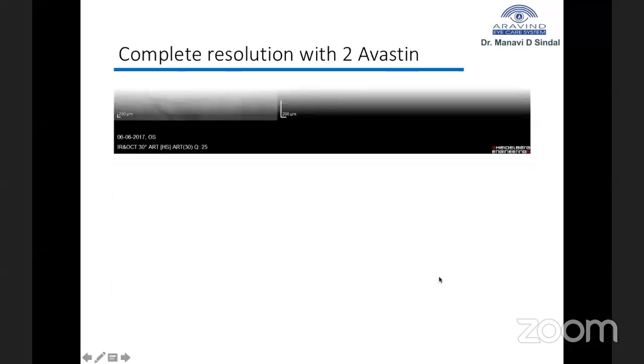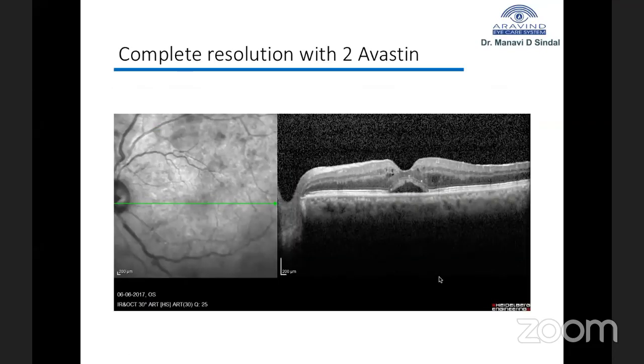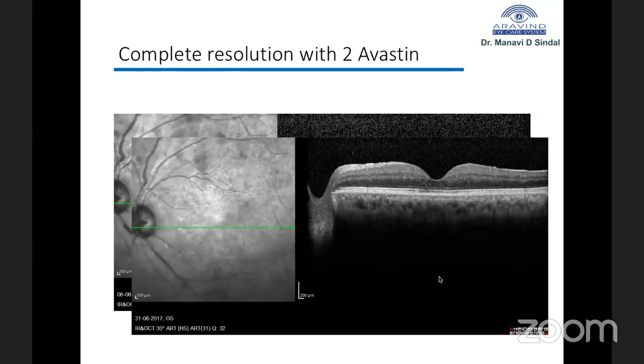So where this is leading us is that one of the hypotheses is that HRF could be indicative of a stronger inflammatory pathology behind the origin of DME. And that is why patients with numerous HRF may do better with steroids or may need an earlier switch over from an anti-VEGF to steroids. This is the message that seems to be coming forth from whatever studies or publications are out on HRF.